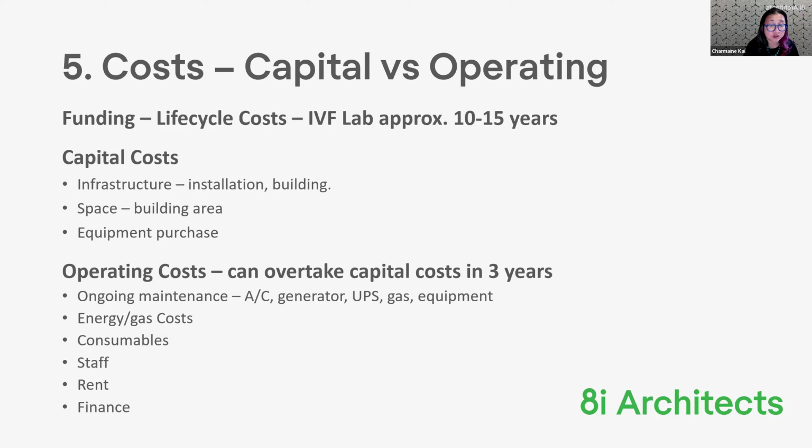So consumable costs, see what you can do in terms of reducing consumables. Maybe have a really good inventory system. I know there's heaps of labs I've been into where they don't even realize how much inventory they actually have within the lab. So streamline that. So, you order as you need rather than having stockpiles, boxes everywhere of consumables.